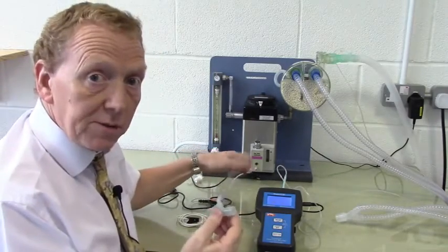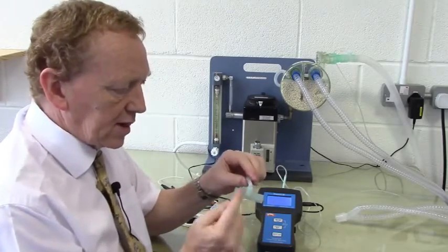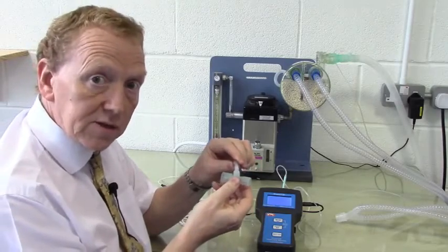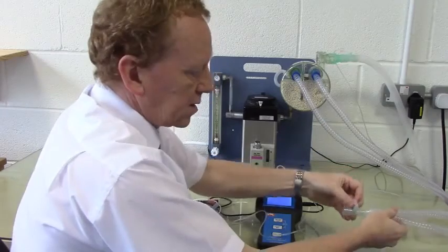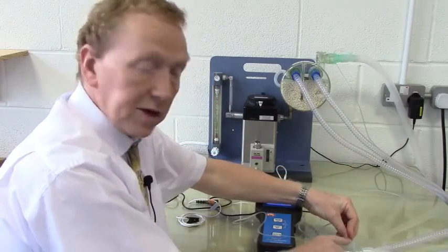When using a side stream device like this, it's important that the sampling point is uphill from the airway. So when this is placed into the circuit near the animal, place it like this and like this, so that any water that forms in here won't drip and fall into the tubing.